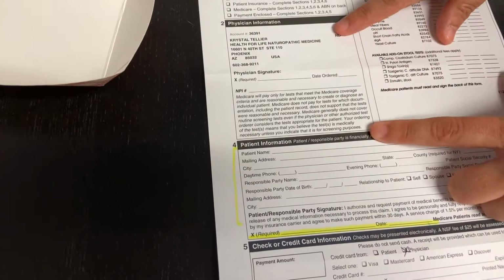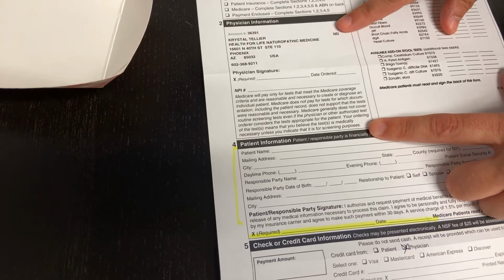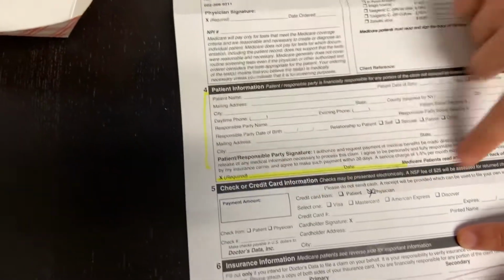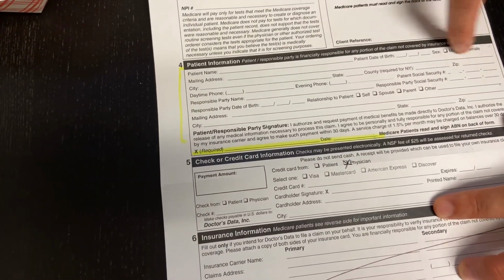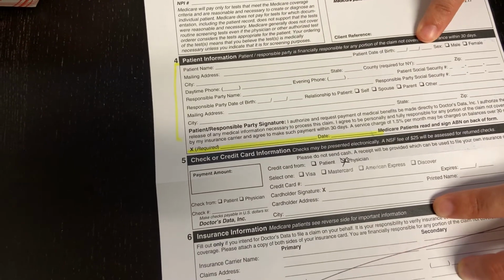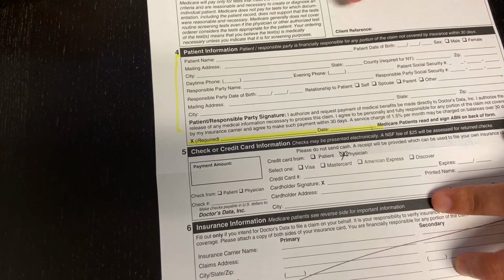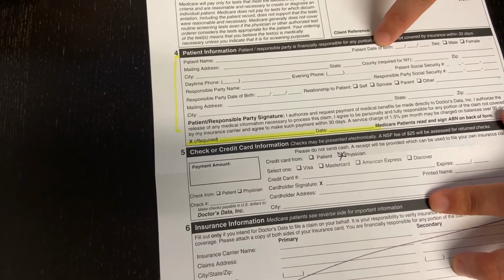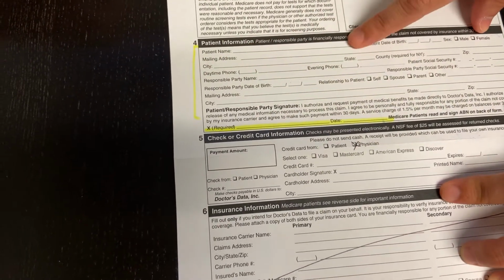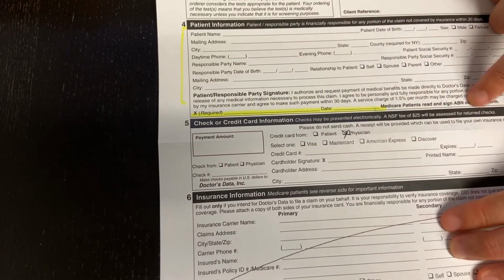Box number 2 may or may not be filled out. It is okay if it's blank. That will not affect the company's ability to complete that test kit for you. Box number 4, this is where we ask patients, if this is left blank, to complete this section with all of their information in nice legible handwriting, making sure that your name, your address. If the sample is being prepared for a minor under 18, then the parent's information will be in the responsible party. The kid's information will be for the patient name, and then signing here indicates that you have read and understood the responsibility statement here.